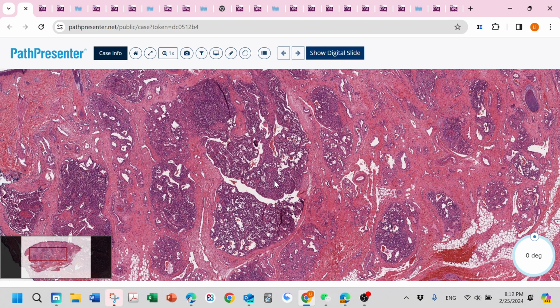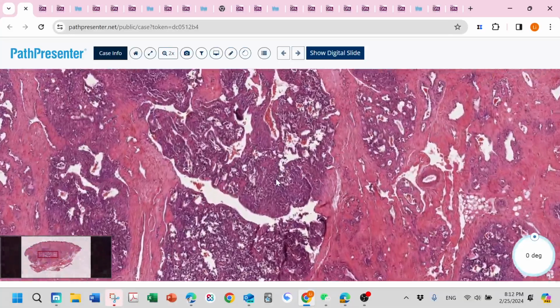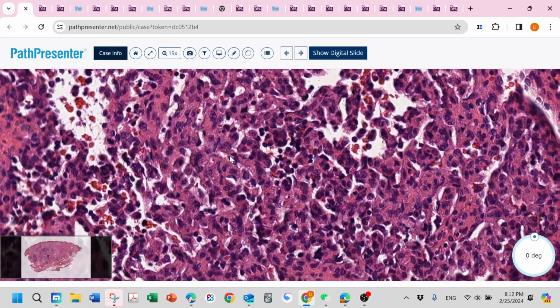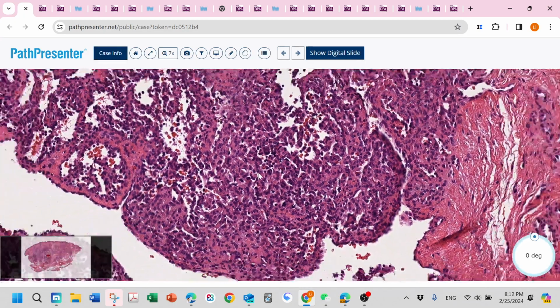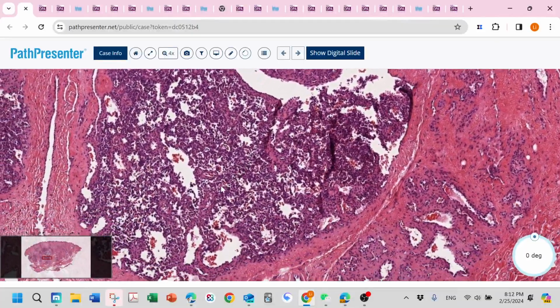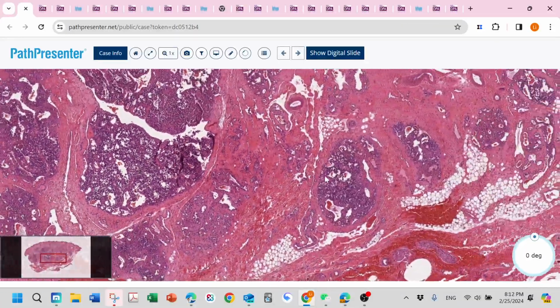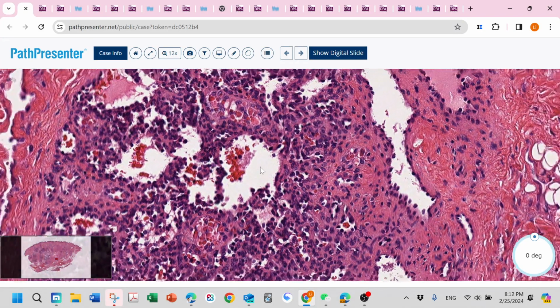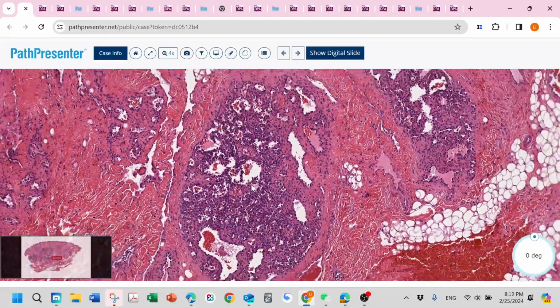In the proliferating phase, you may see mitosis, but this is still benign because you have a really good clinical history. This lesion is from an infant. And then the cells are really monotonous. You do not see really hyperchromatic cells there.